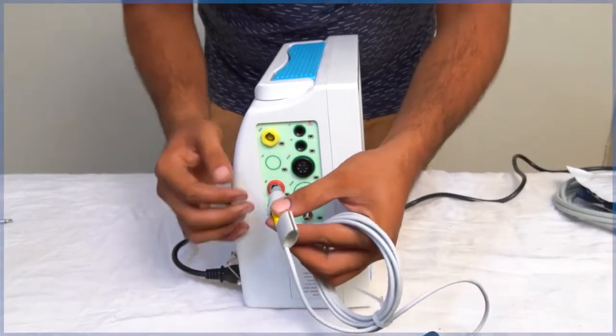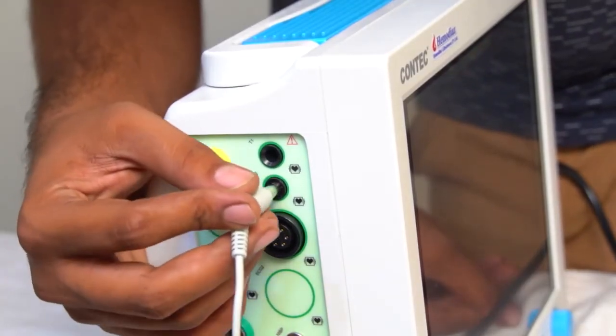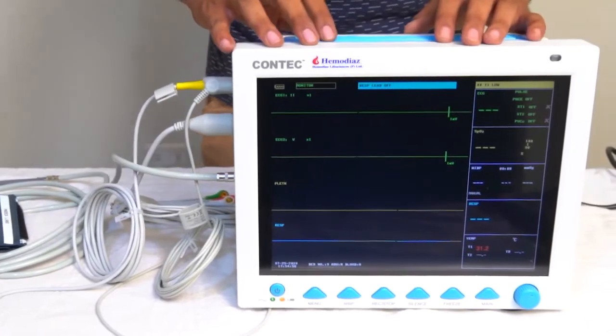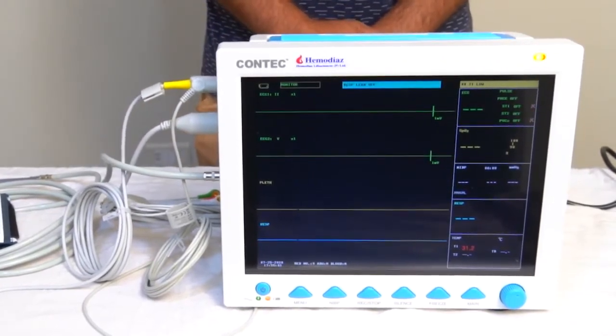Connect the SpO2 sensor cable to the port for measuring the SpO2. Now connect the temperature sensor wire in the given socket. The CMS8000 patient monitor is ready to measure the parameters such as respiratory rate, NIBP, SpO2, and dual channel temperature of the patient.